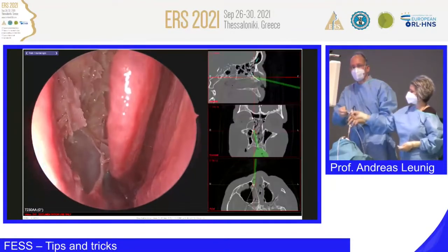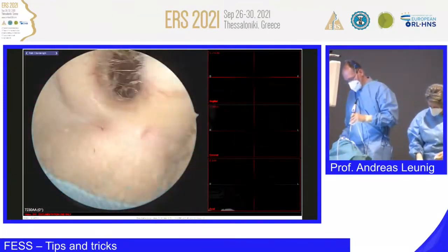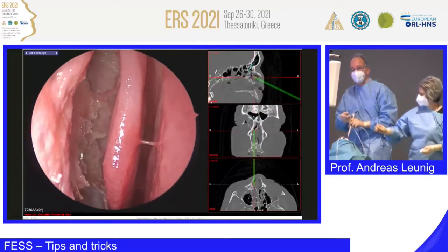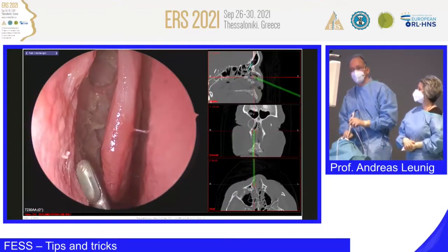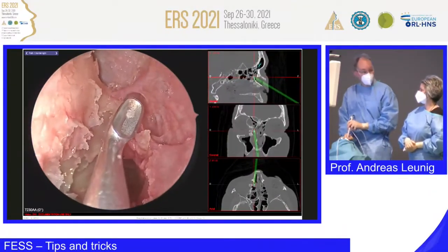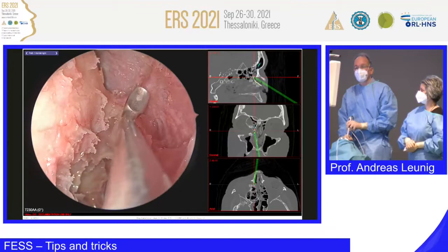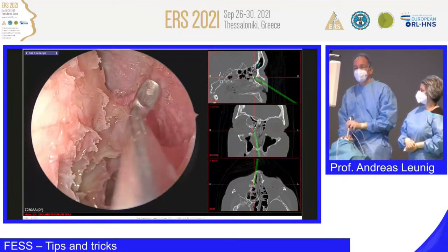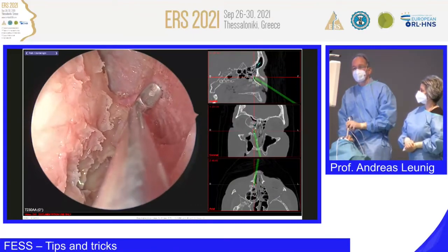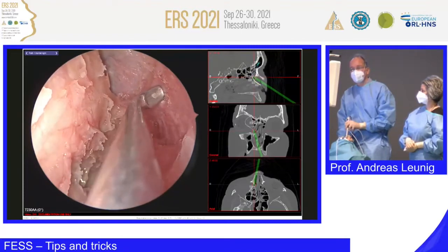Okay, so now maybe demonstrating what you should avoid by showing you how you can create a CSF leak. Please. Let's see if I can show it to you in the right way. So here it's tiny, very tiny, and that was a question of you, thank you very much. So this is the artery, and the artery is here going into the anterior skull base, and maybe when you're pushing too much, either you have a bleeding and a CSF leak.